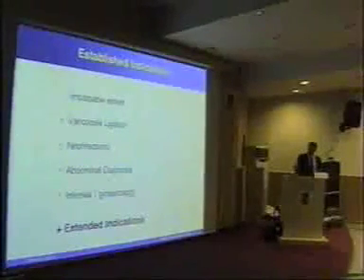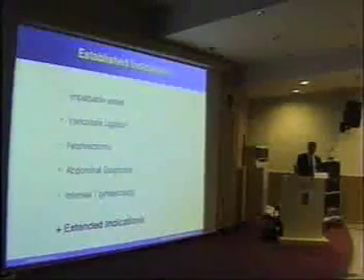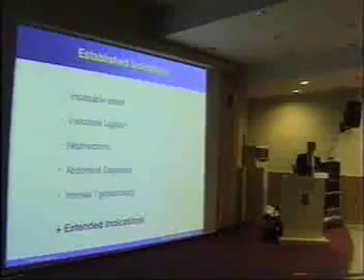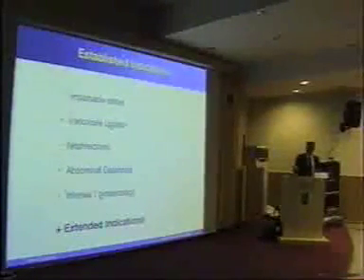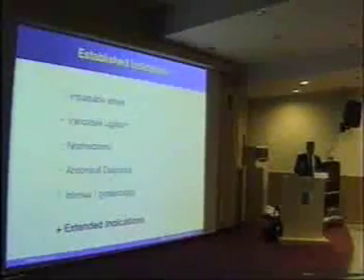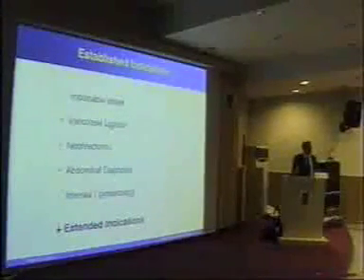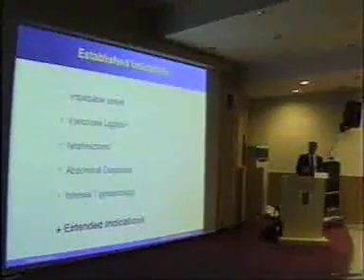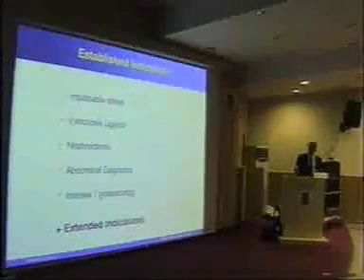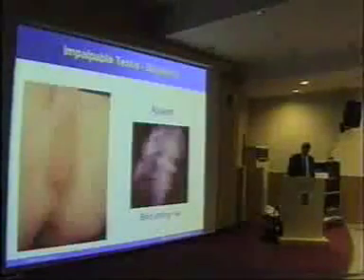But most laparoscopic endourologists doing pediatrics are now doing their nephrectomies that way. And I haven't done an open nephrectomy now, apart from for Wilms tumour, for about the last 5 or 6 years. Abdominal diagnosis is another area, although it's small, and that is particularly the case when we're looking at intersex conditions and we're trying to diagnose the internal gonad situation. It's a very useful tool. And there are a few extended indications, and things are moving forward all the time, that we'll talk about as well.